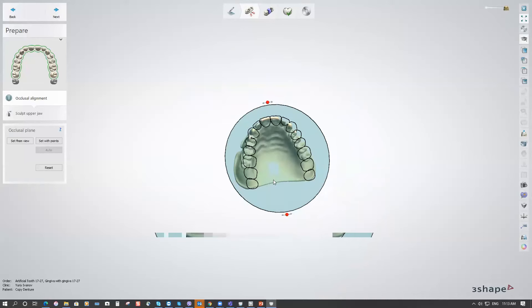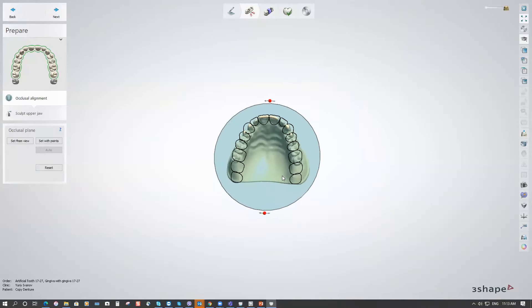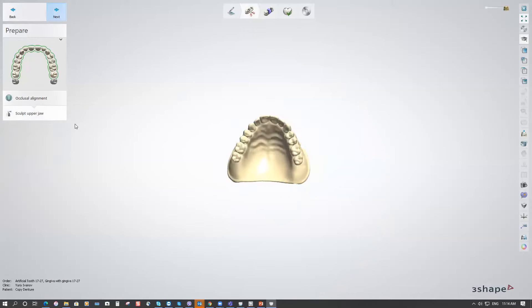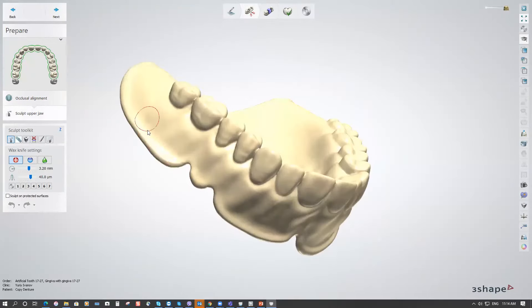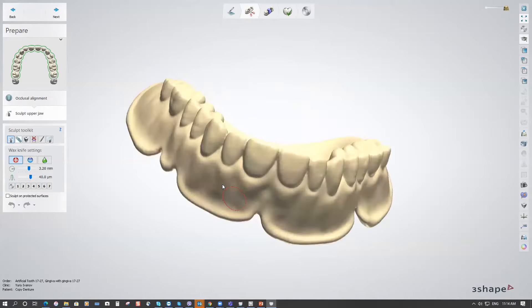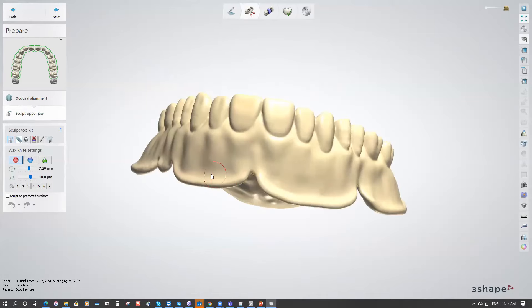It can be done in just a couple of clicks. Hit Next to go to the Sculpt step over the upper jaw. If there are any artifacts like wash impression material outside the intaglio surface, you can remove that wash material and smooth it to get a nice surface on the base. There's still one more Sculpt step later in the anatomy design steps.